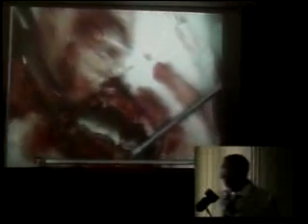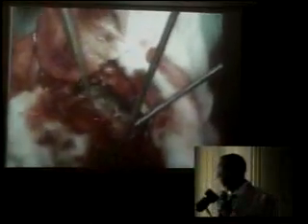So you can see, now I am resecting the capsule, and I have to continue with that, and I must tell you, you might not see all here. I have to continue till the roof of the orbit. As well, I have to go to the other side so that I can visualize the area of the operation. So that is being resected, and at the end of the operation, that is how it looks.